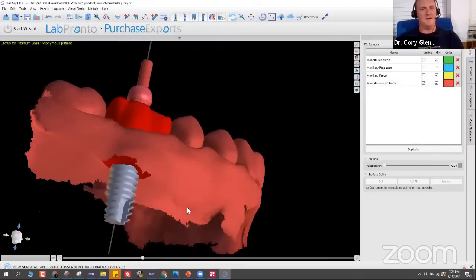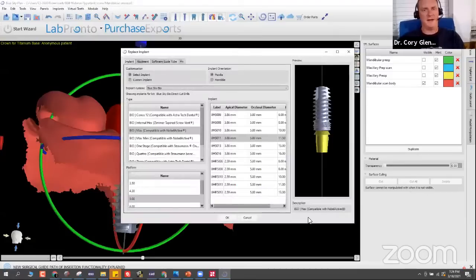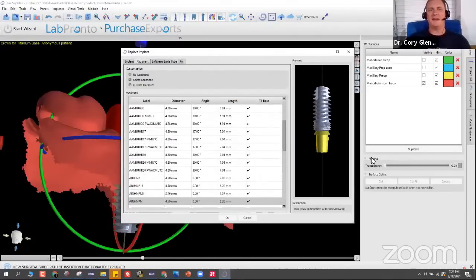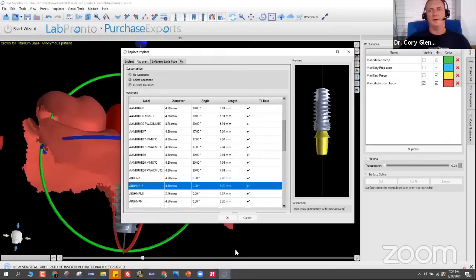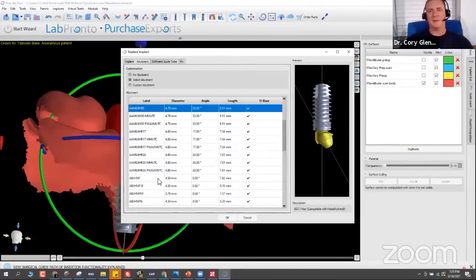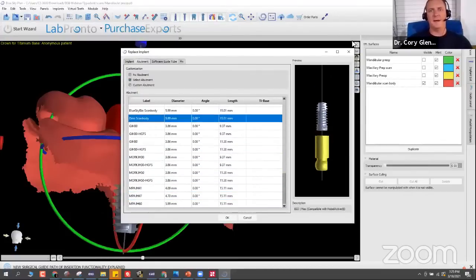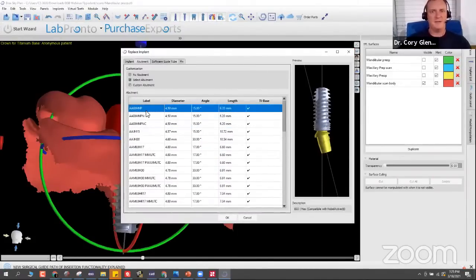And you can see that it's aligned the implant underneath it. And you can swap that out to whatever, you know, this is going to be a Biomax 5x10, let's say. We can also indicate what abutment we're going to use. Okay, so right now, just the standard tie base is on there. But, you know, if I wanted to use, for example, that 1.8 millimeter emergence tie base that we have, I could swap out for that. The cool thing is I can also swap out for any of the stock abutments that are in Blue Sky. So I could position any of those and take a look at them as well. You know, a kiss abutment, something like that. But since we're going to do the tie base here, I'm going to just go back to the tie base.